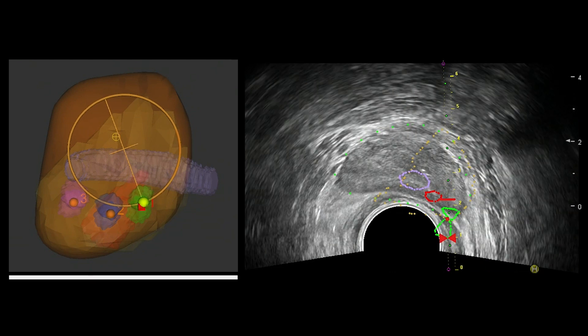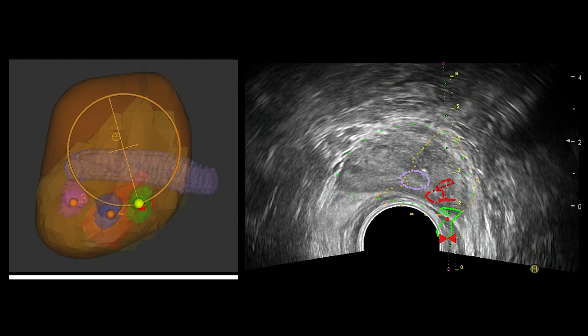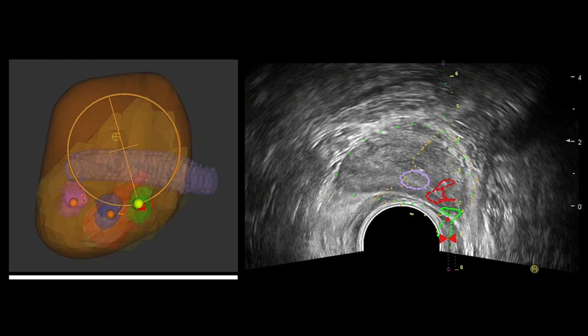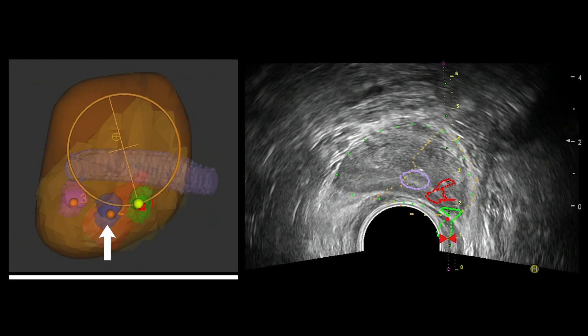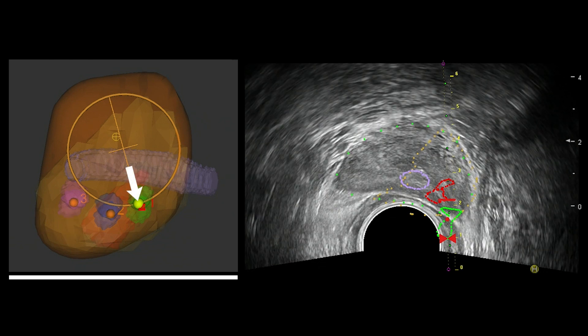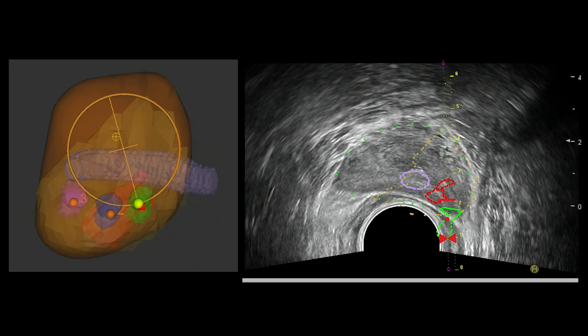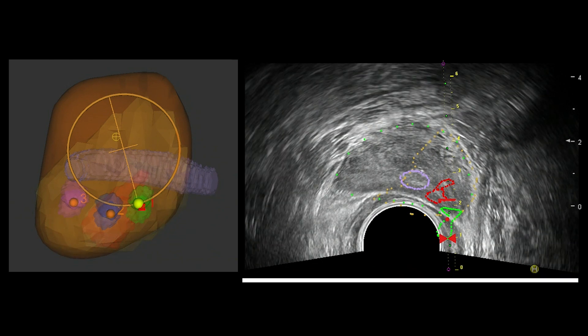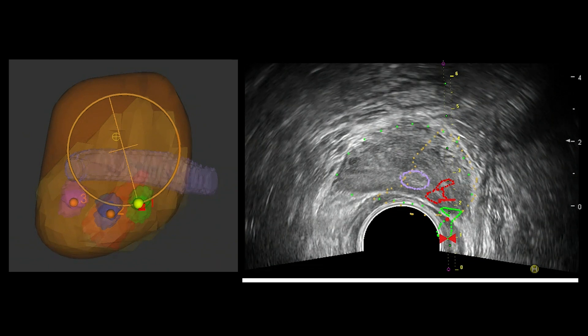On the left is a 3D model of the prostate with urethra in purple, ROI in red, and three planned ablations marked in green, blue, and pink. The yellow circle represents the orientation of the ultrasound probe relative to the prostate. On the right, this information is overlaid on the live 2D ultrasound image to guide the practitioner to the desired ablation site.